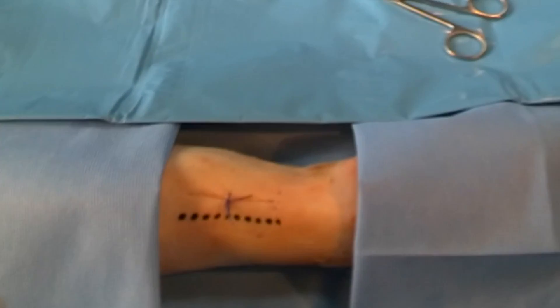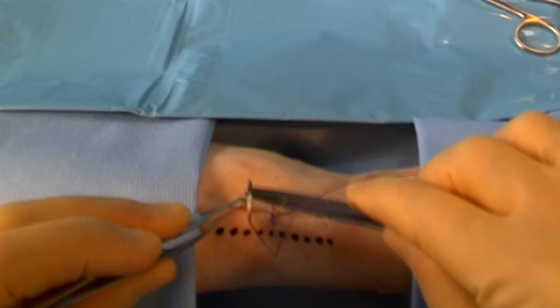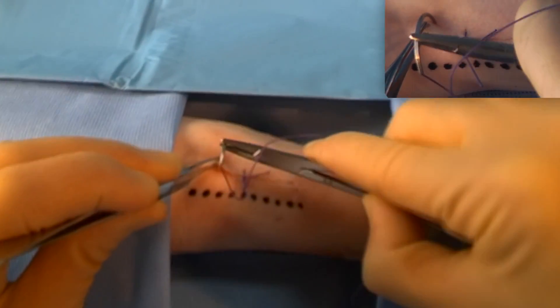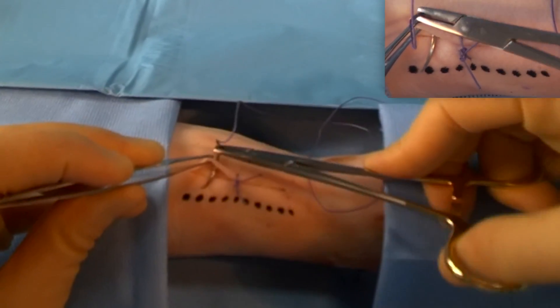Now we're going to do that again, roughly a centimetre away, and this time demonstrate how to do an instrument tie. So we're going to come into the wound, approximately perpendicular, again using the curve of the needle.